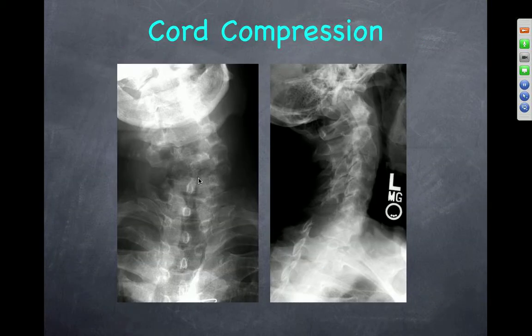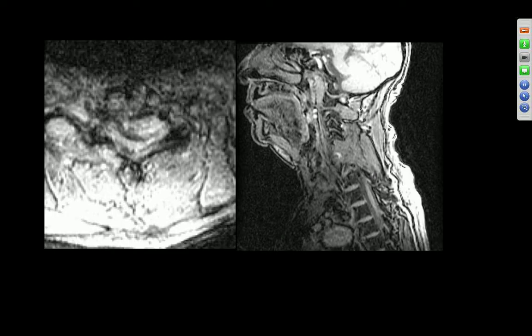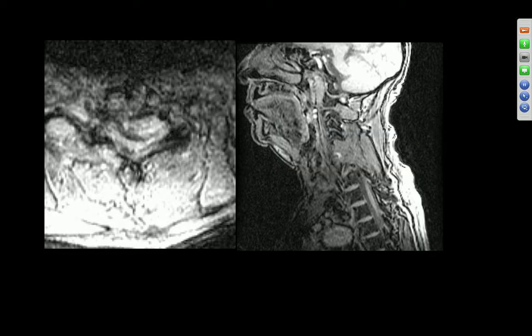Okay, Brian. All right, well, we're missing a chunk of posterior elements on the right side, the mid and lower cervical spine. It's obviously lytic, and there's a pathologic fracture through C6, and there is some convexity posteriorly, so be concerned about metastasis and some compression of the cord there. Yeah, it looks neoplastic. Doesn't necessarily have to be from metastasis. It could be a primary too. Sure.